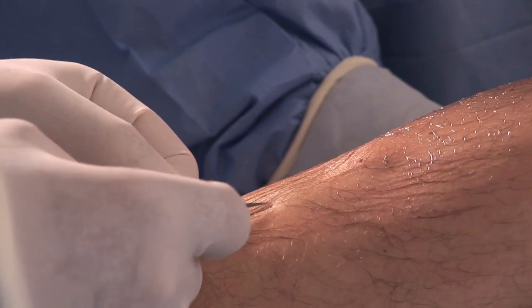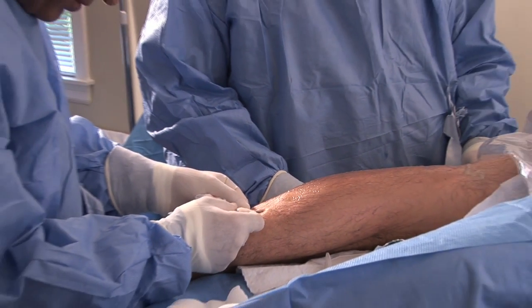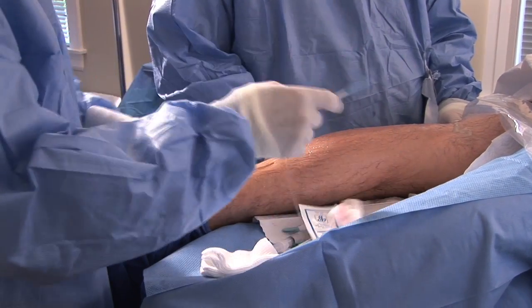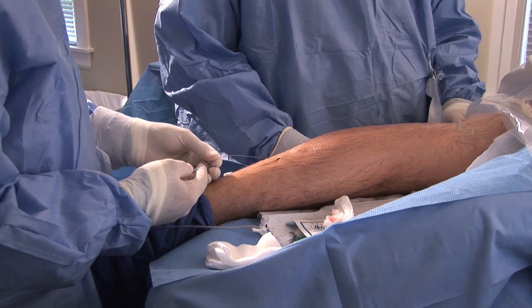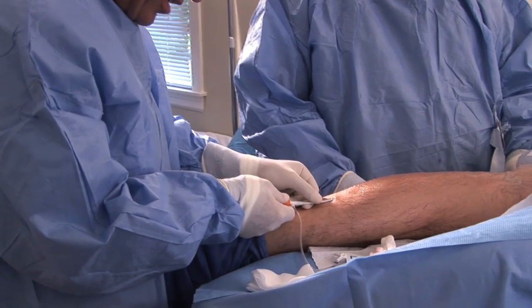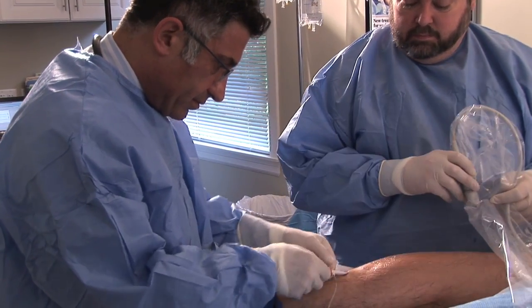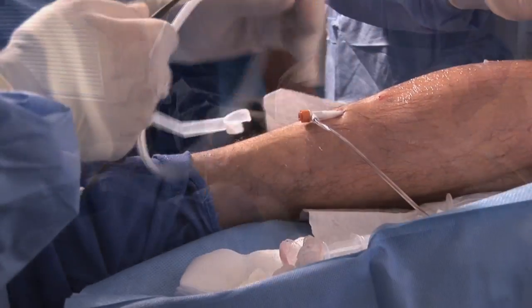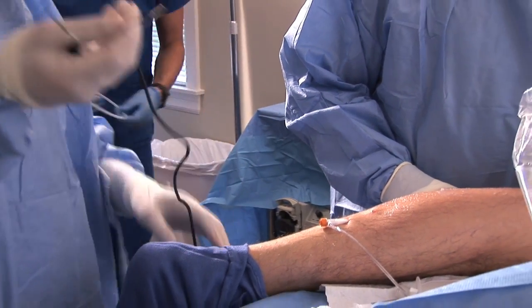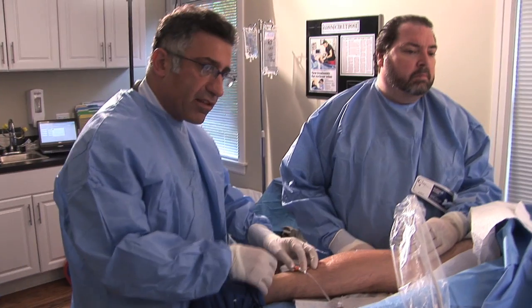A very tiny incision is made. A microintroducer is introduced into the vein. Then we remove the guide wire and insert our radiofrequency catheter. Once again, we check with the ultrasound to make sure that our microintroducer is in the right place. Ultrasound is a great tool to make sure that we are always in the right location and where we are with respect to other structures.